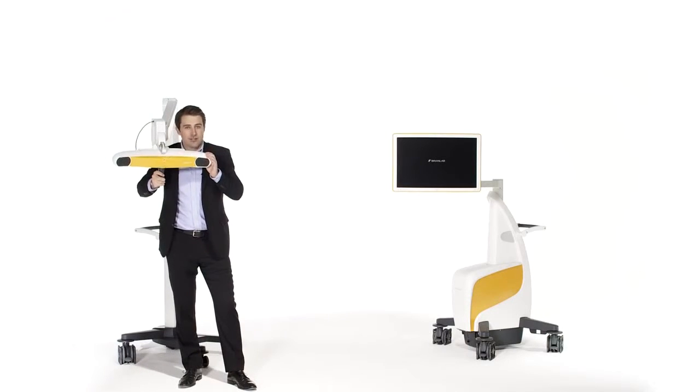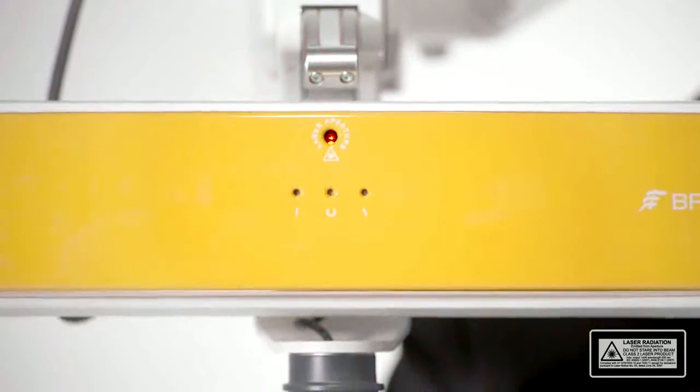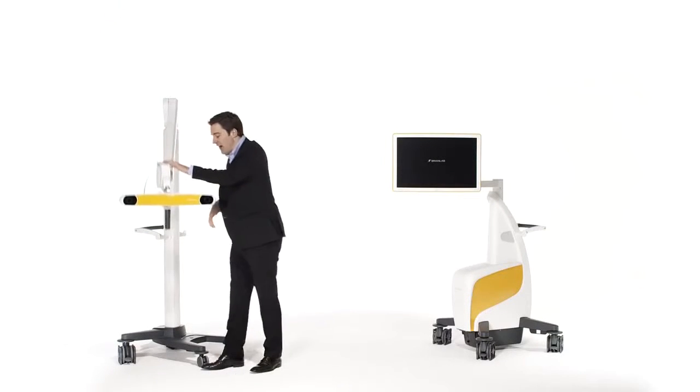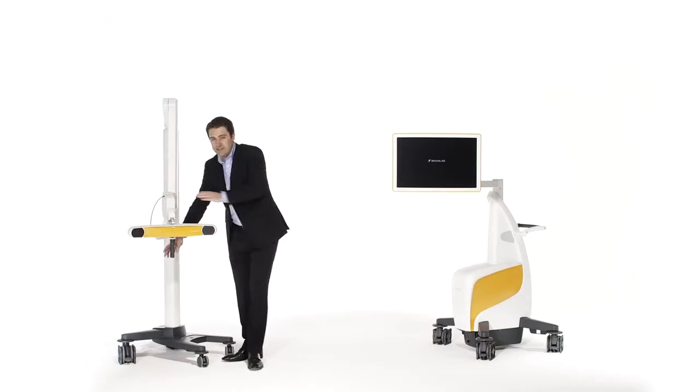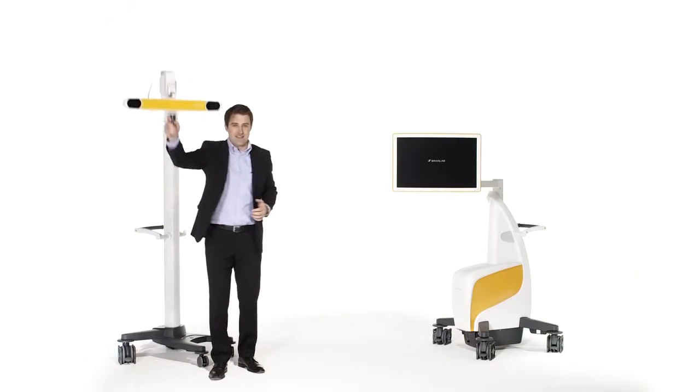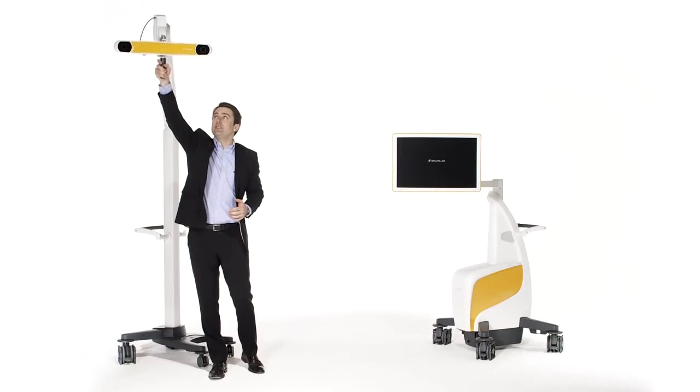The laser pointer is valuable for establishing the camera position even before the system is turned on. The camera stand offers a range and height adjustment from 100 cm or 39 inches up to 216 cm or 85 inches.